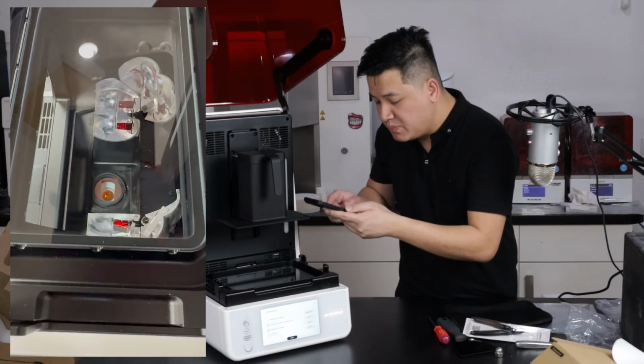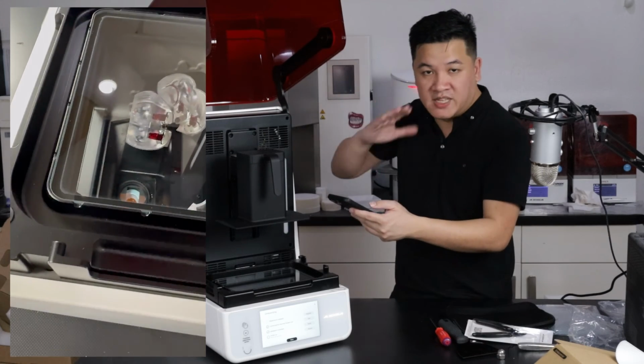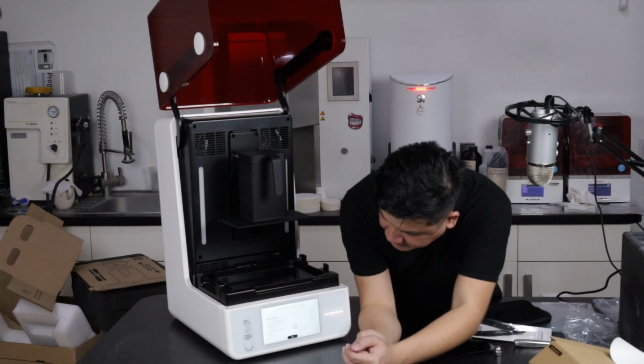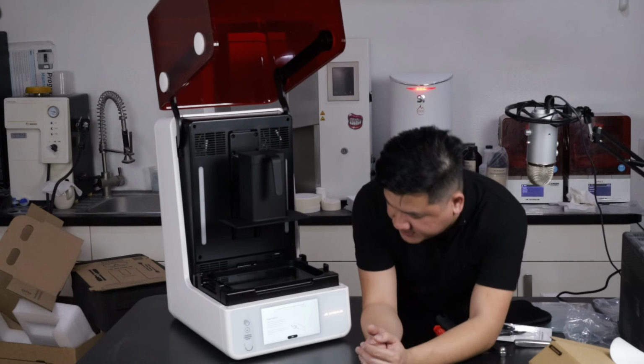So this looks much more like a mini. It's a 4K projector, I know that. So it's form factor of slightly bigger than a Max, with a 4K projector and an almost Pro 4K size build platform. Very cool. Hood gesture. This machine is equipped with a proximity sensor that allows you to operate the hood without touching the sensor. Move your hand back and forth in close proximity to the sensor to activate it.